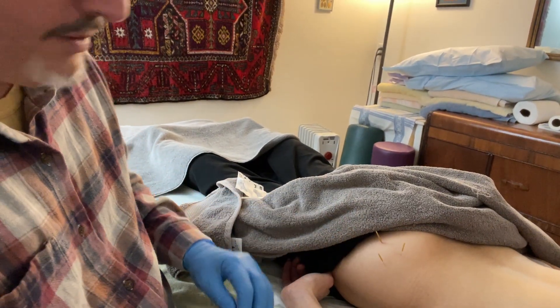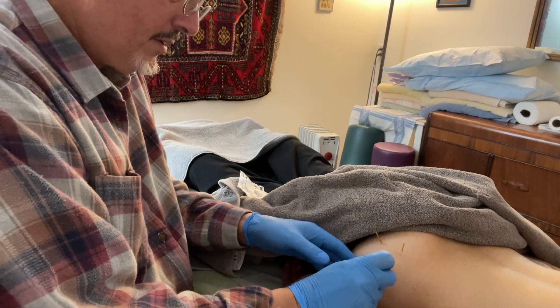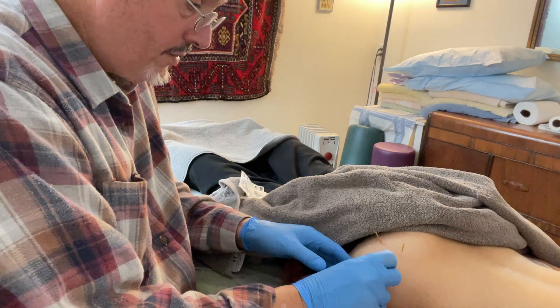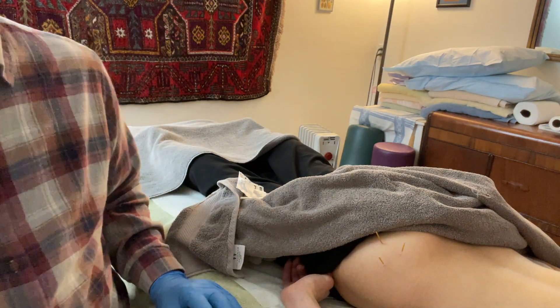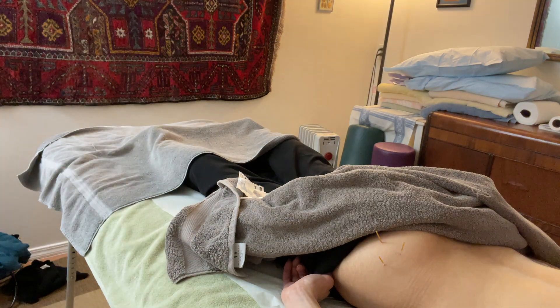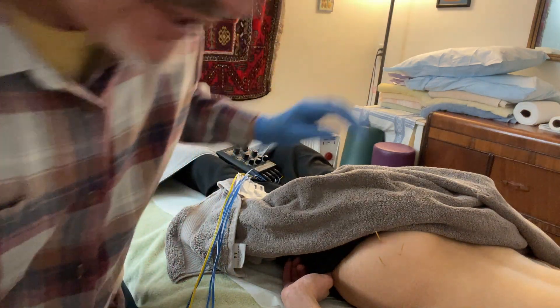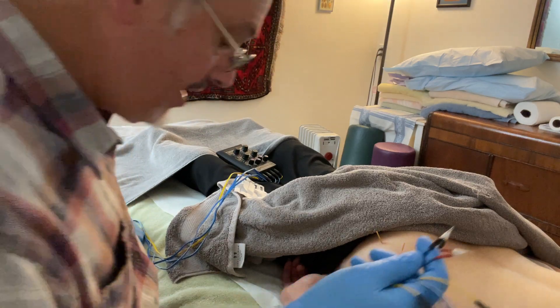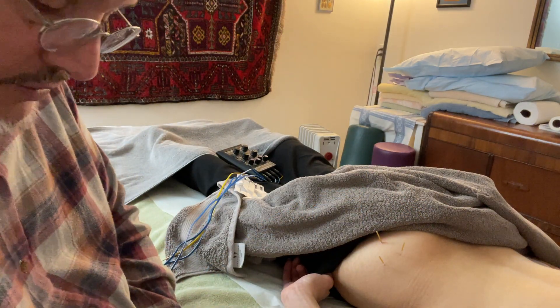I need both hands now. I'm going to add some electrical stimulation, because when someone says you could do that all day, that's a really good case for doing the electrical stim. The Chinese invented electrical stim, not physical therapists. It's part of Chinese acupuncture, electrical stim.